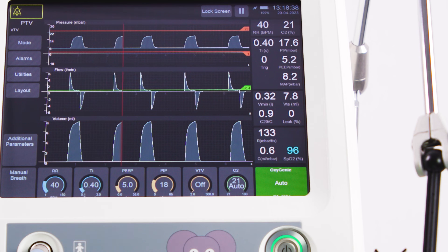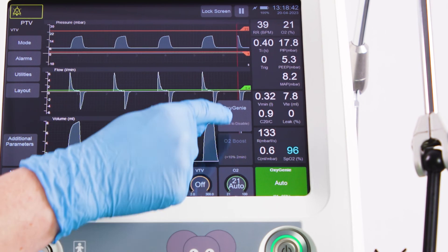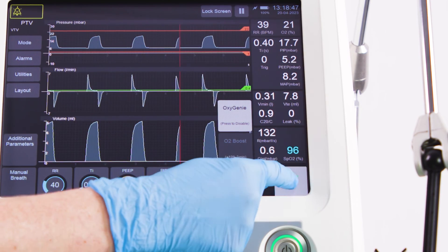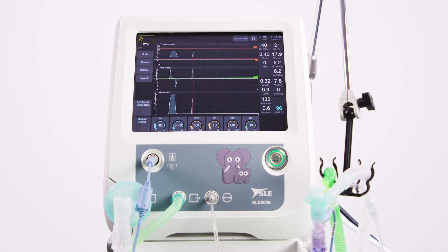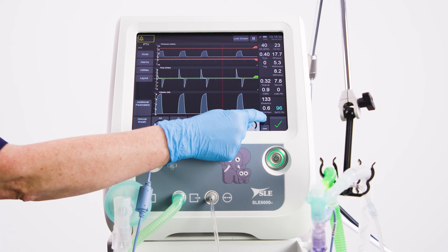To turn off Oxygeni, press and hold the O2 control. An option appears above — press to select this and then press Tick to confirm. Oxygeni will turn off and the O2 level will be restored to the last reference O2 level. Users should then manually adjust this level as required.